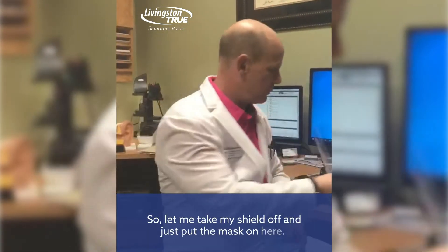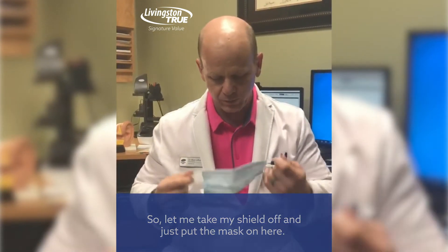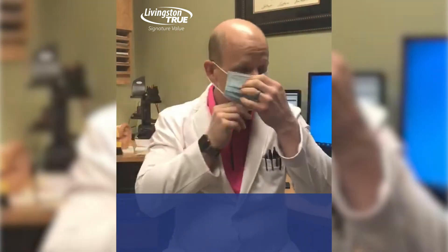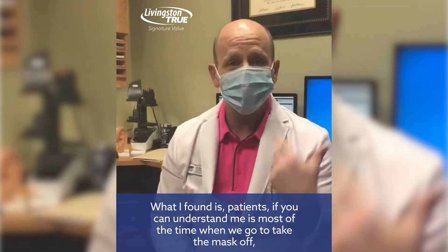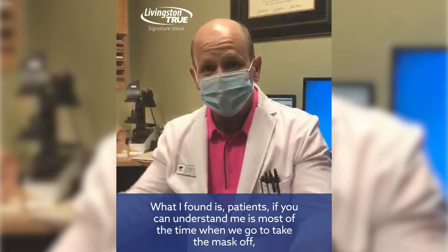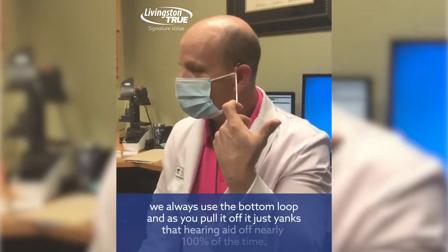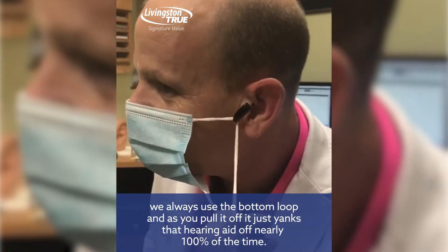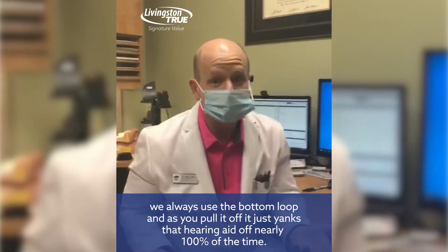So let me take my shield off and just put the mask on here. What I've found with patients is most of the time when we go to take the mask off, we always use the bottom loop, and as you pull it off it just yanks that hearing aid off nearly a hundred percent of the time.